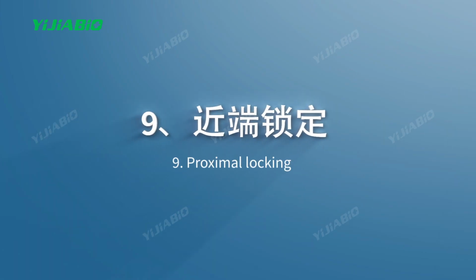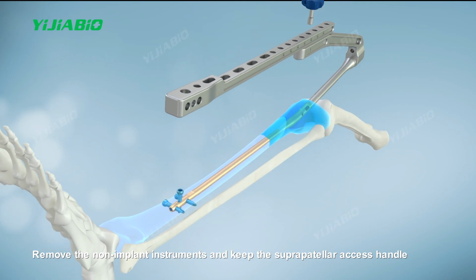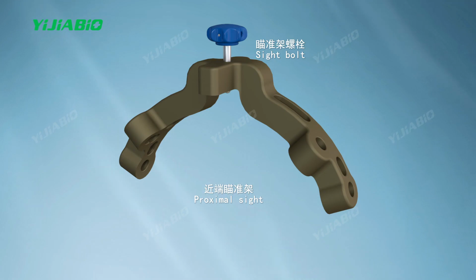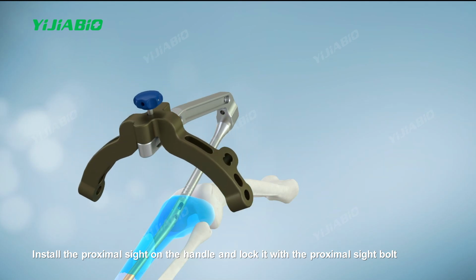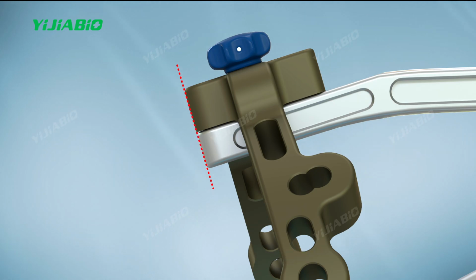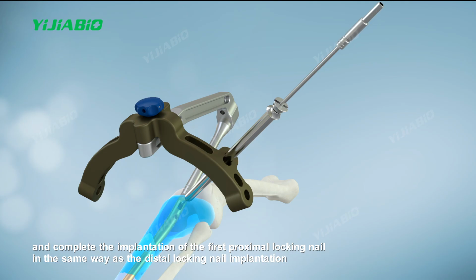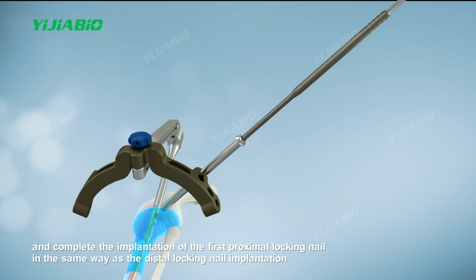Nine, proximal locking. Remove the non-implant instruments and keep the suprapatellar access handle. Install the proximal sight on the handle and lock it with the proximal sight bolt. Insert the locking nail protection sleeve, locking nail drill sleeve, and locking nail trocar through the dynamic locking hole channel, and complete the implantation of the first proximal locking nail in the same way as the distal locking nail implantation.